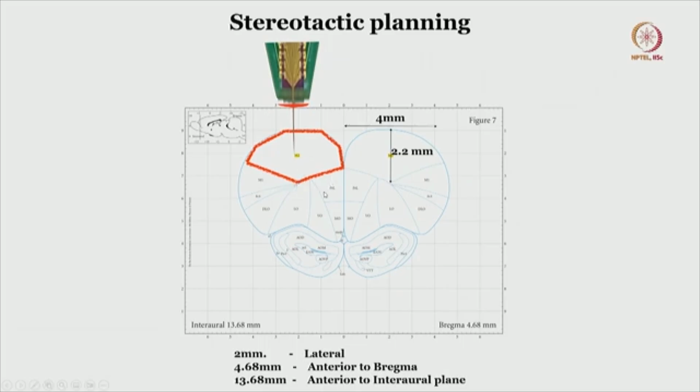So, use the coordinates from the atlas or from the literature, but confirm it, reconfirm it, triple check it: where you are going to hit it, what is the center of the target, and what is the dimension of that particular target that you are going to study. If you suppose target only the eccentric portion of the target unknowingly, and your coordinates are mistaken, you probably get a very different data, or a mix of data, or false data, if you implant it in a different place.